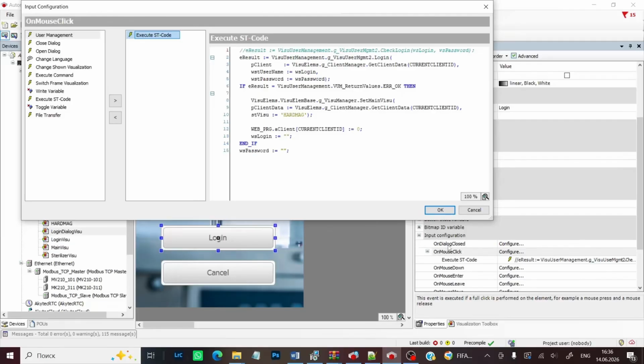For the login button, as the click event handler function, I selected the execute ST code function. The commented out expression will be needed in the future to check user permissions before performing confirmation actions. The next expression authorizes the user in the system using their username and password. In the case of successful user authorization, I set the main control visualization of the automated system for the specific browser client, and also switched to the main instance visualization inside the frame element. Next, I reset the username and password so that old data is not retained after the authorization attempt.